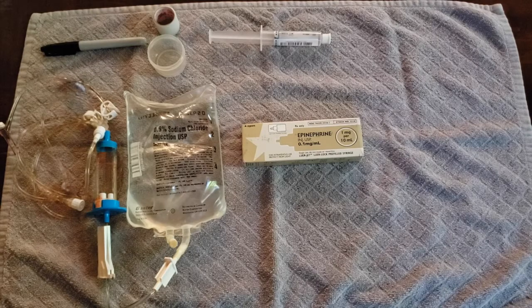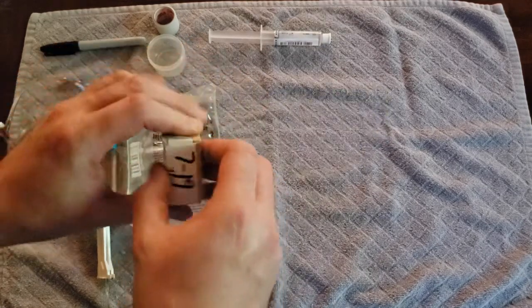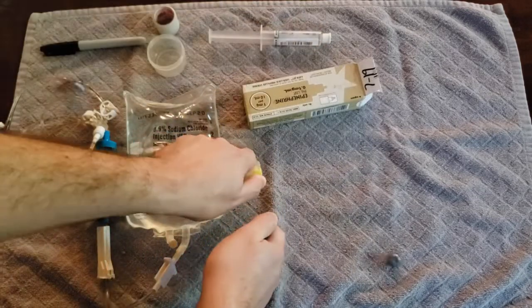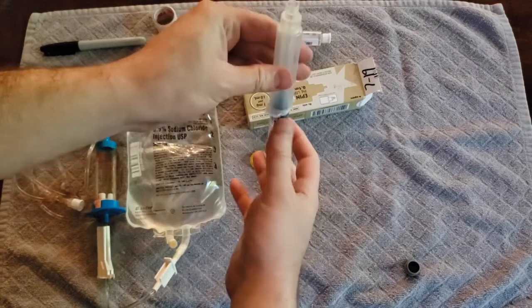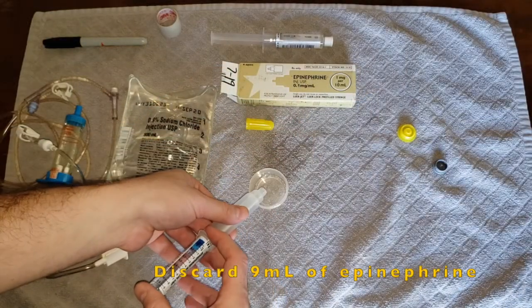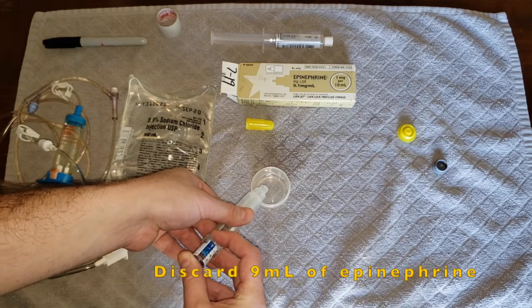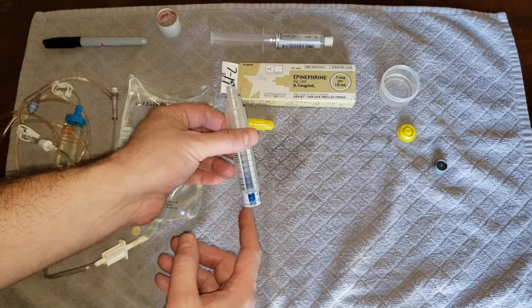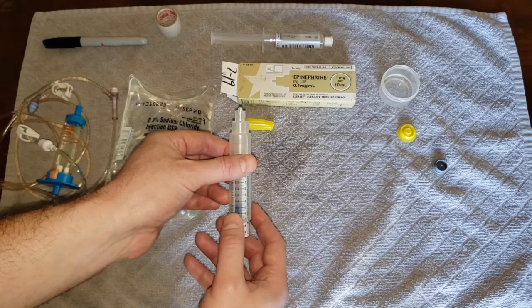To prepare push-dose epinephrine, begin by taking your preloaded epinephrine syringe, assembling it like you normally would, and getting rid of any air. Remove nine milliliters of your epinephrine — we're now left with one milliliter of epinephrine. We're going to add nine milliliters of saline to the syringe now in order to dilute it.